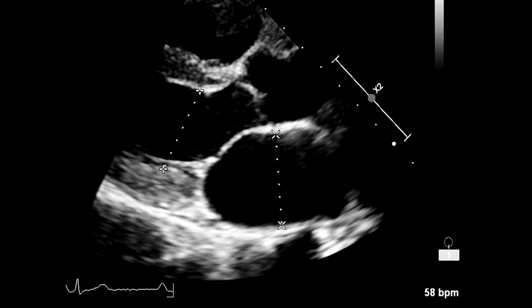This is how to properly measure the left atrial diameter. Just remember that you have to freeze the image at end of ventricular systole, and that you have to measure the diameter perpendicular from the posterior aortic wall to the posterior left atrial wall.